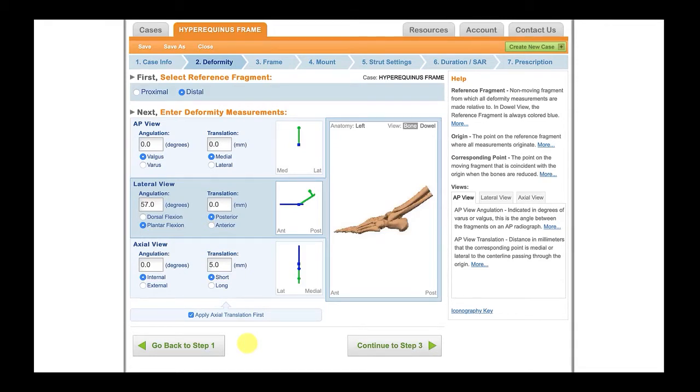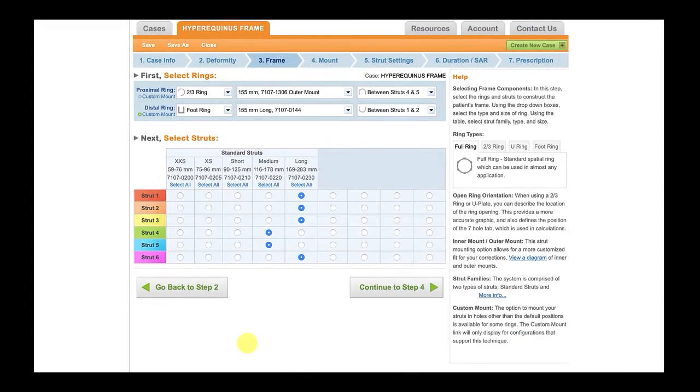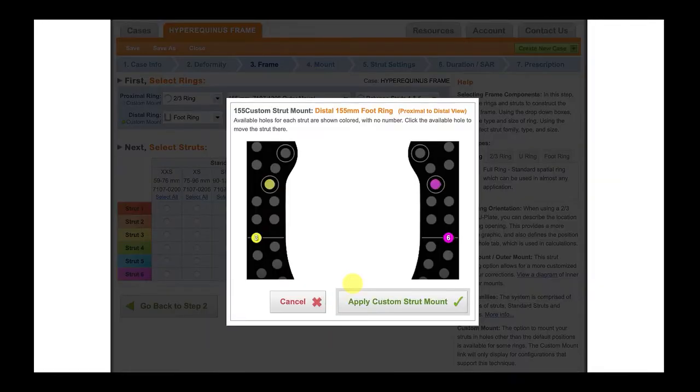The next panel that we have to look at is the frame parameters. And here we get to put in the size of the ring. So I've put in here that I used a 2/3 ring, 155 millimeter proximally, and a foot ring, 155 millimeter distally. The struts that we use were mostly longs, but number 4 and 5 were medium length struts. So we put that in as well. Now we'll go on to the next frame, which is the mounting parameters.